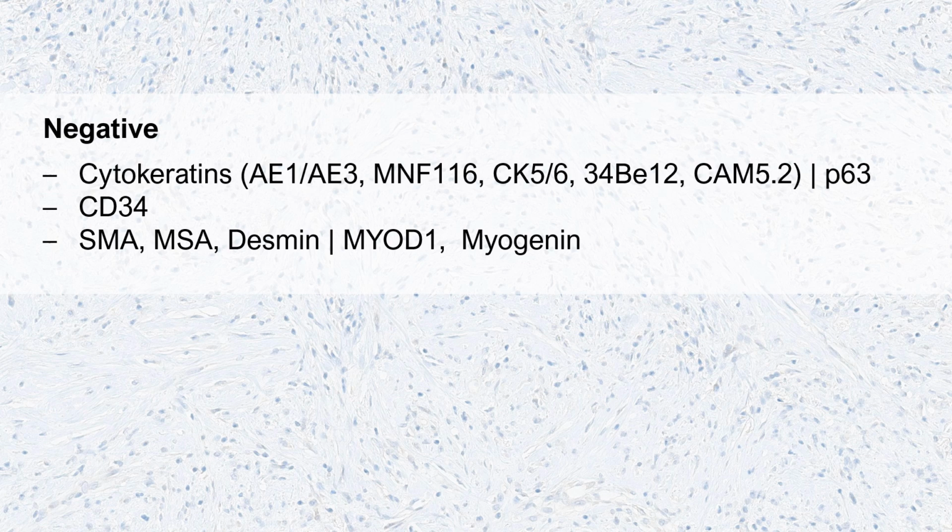I thought about, okay, maybe this is stromal overgrowth of a phyllodes tumor. CD34, though, was negative. As I mentioned, CD34 can be negative in phyllodes tumors, particularly as it progresses towards a malignant phyllodes, but I would expect to see maybe a little bit of staining, though I didn't totally exclude this differential. I next thought about, is there any way that this is just a primary sarcoma? So the patient had not had any previous history of radiation, but we know that primary sarcomas can arise in the breast in the absence of radiation therapy.